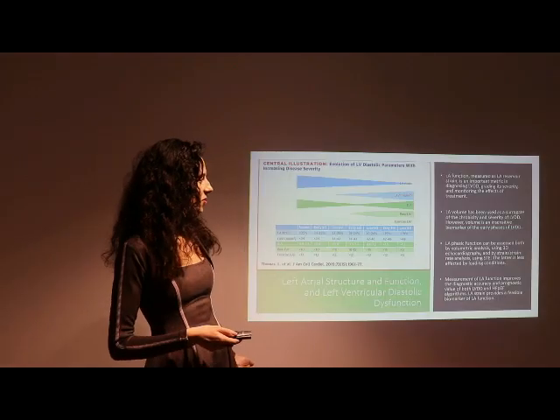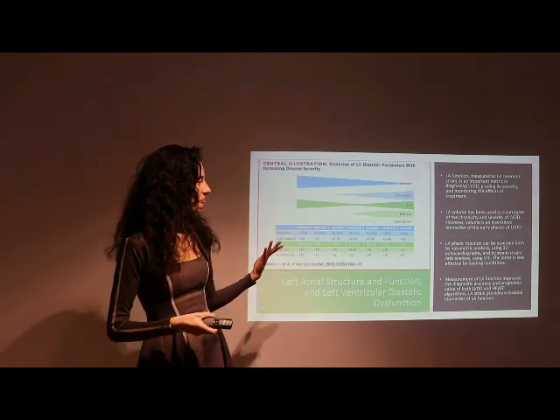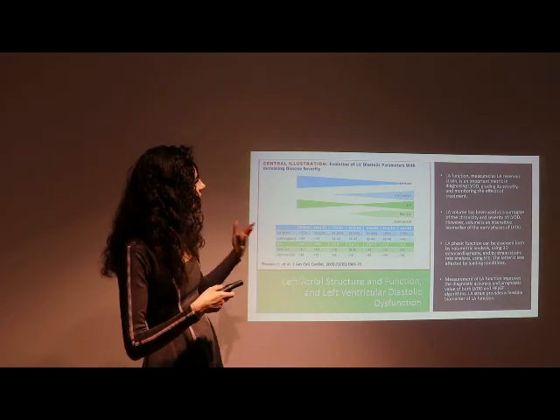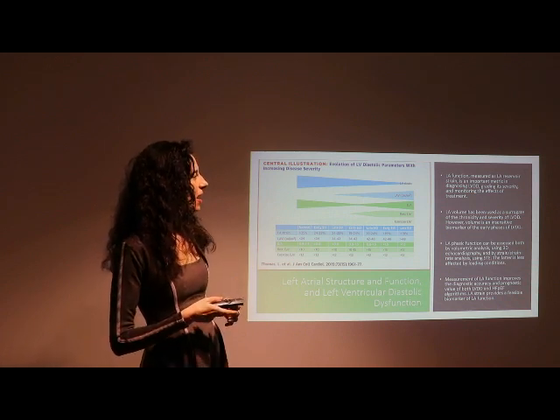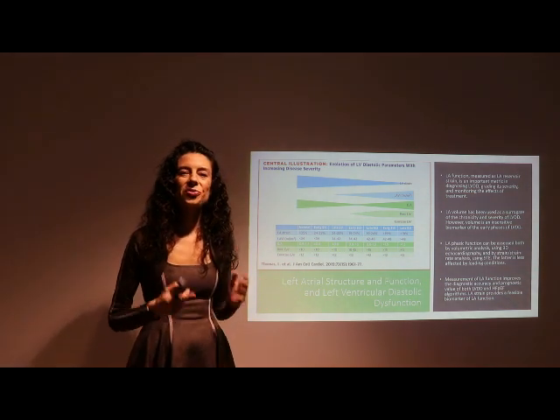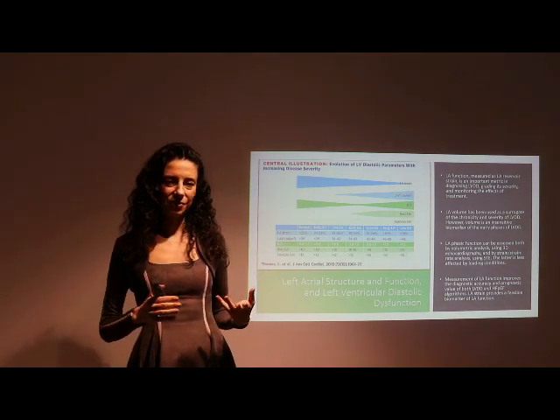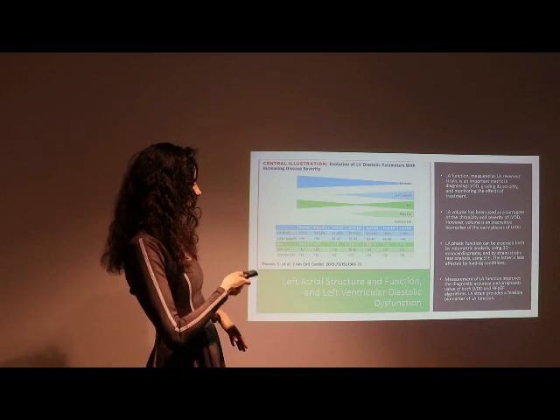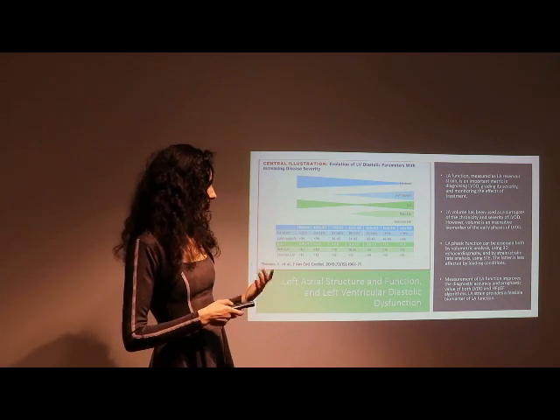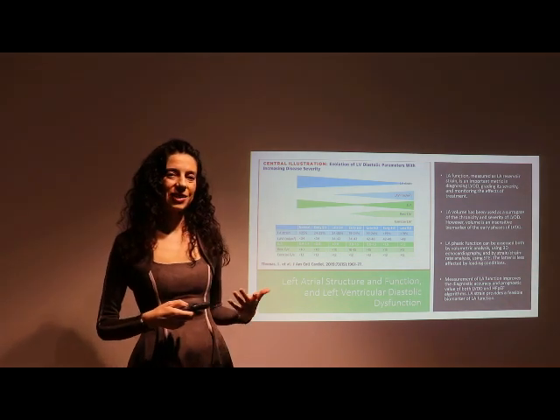So another useful study, again from the year 2019, which analyzes the strain of the left atrium, is this diastologic study. It is about the function of the left atrium and left atrial strain as the measure to differentiate between the very early stages of diastolic dysfunction. And as you could see in this figure, the stages of diastolic dysfunction have been divided in an early stage 1 and late stage 1 diastolic dysfunction.